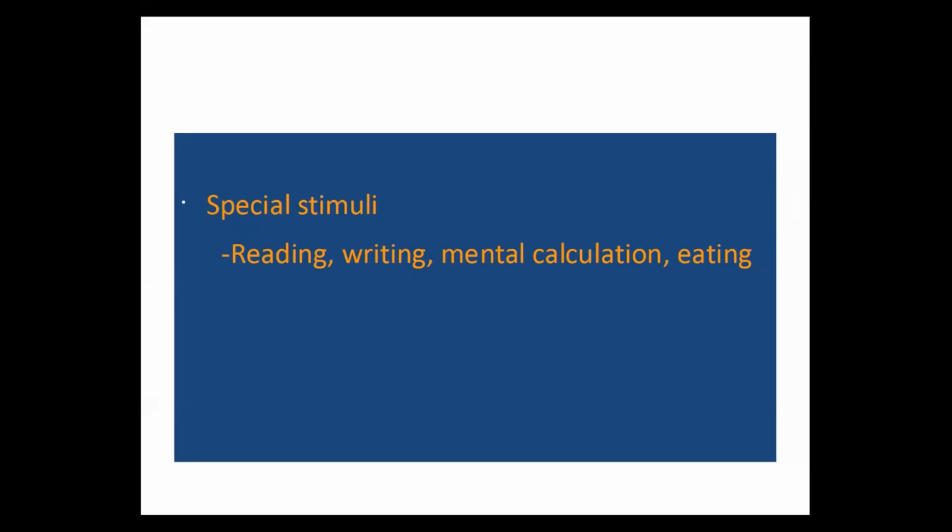Then you can also have sleep or sleep deprivation, as well as the various other stimuli which I mentioned, based on the individual case. So in a regular EEG, it's better that we include most of the activation procedures, which would include hyperventilation, photic stimulation, sleep, and also might include sleep deprivation if you ask the patient to come sleep deprived the previous night. So these are all the normal activation procedures which are included in the routine EEG.